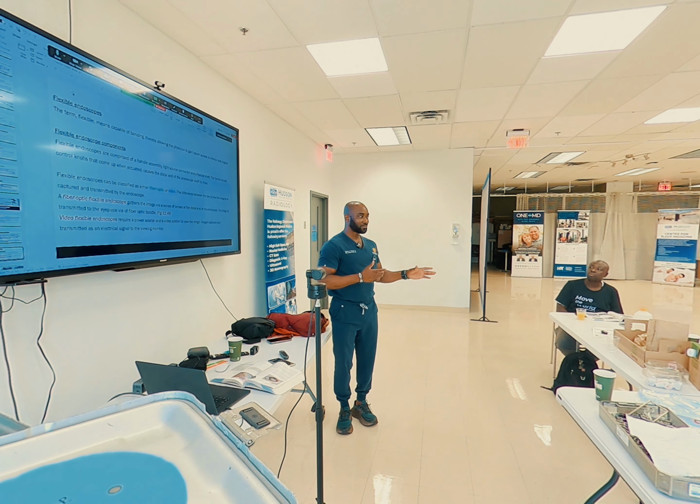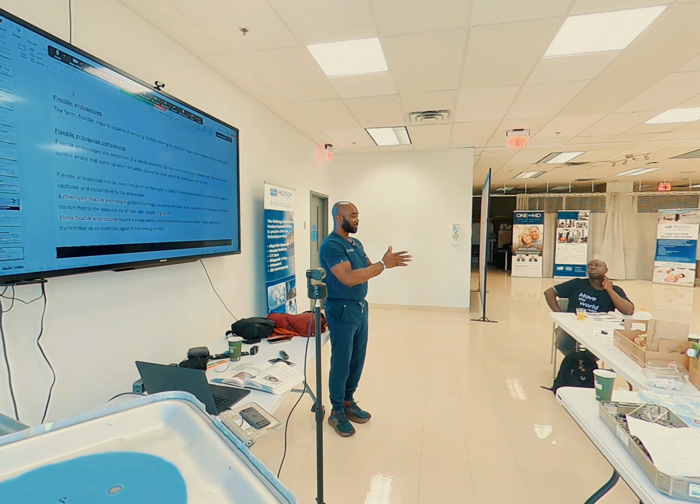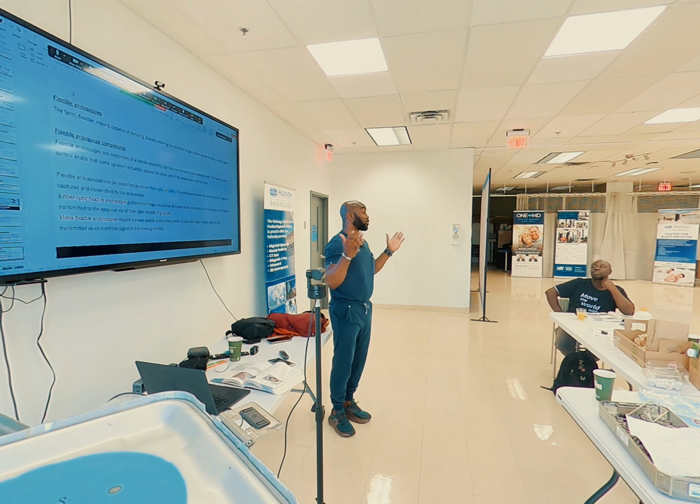Is it confusing? Yes. Either way, you can perform a manual high level disinfection if you do not have an automated endoscopic reprocessor. You cannot perform a manual high level disinfection of a semi-critical device if you have an automated endoscopic reprocessor in your facility. You shouldn't do it because it's only supposed to be automated. The only time you can do it without automation is when you don't have any machine in place.